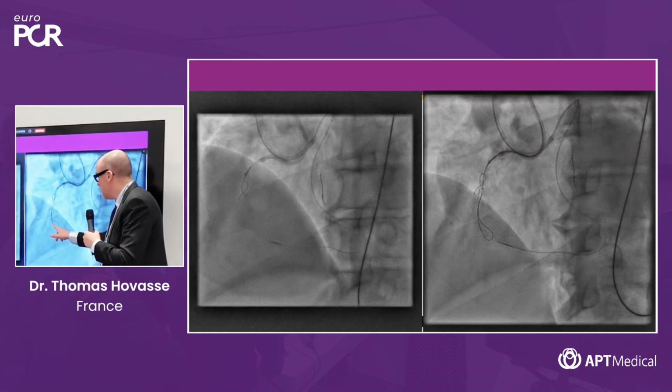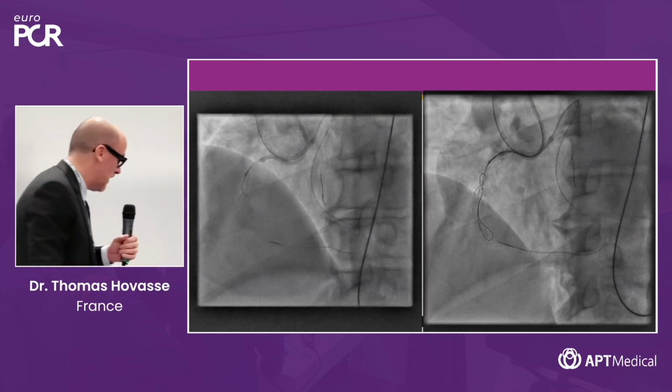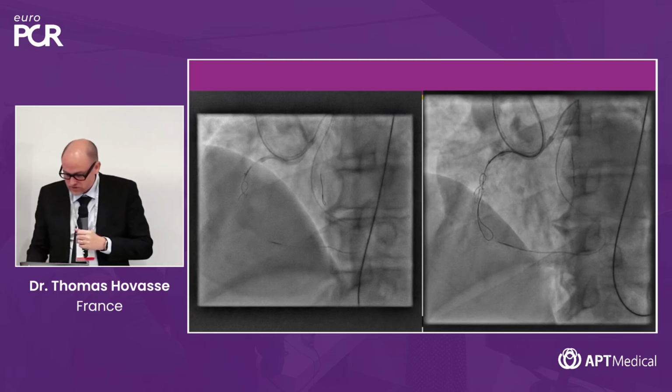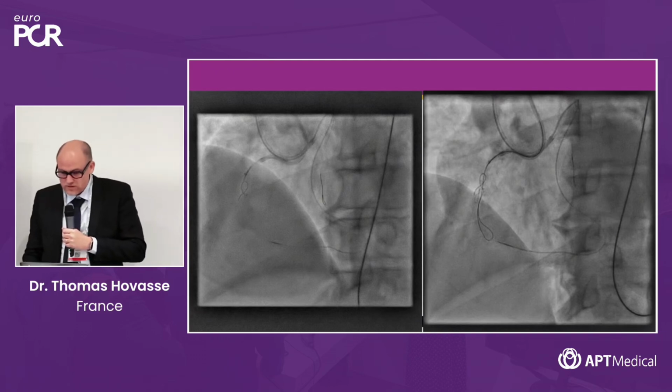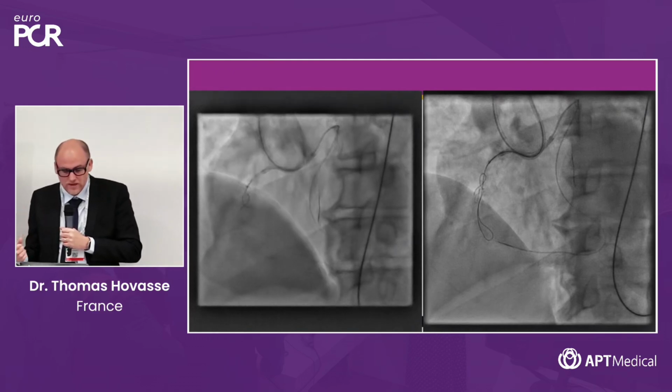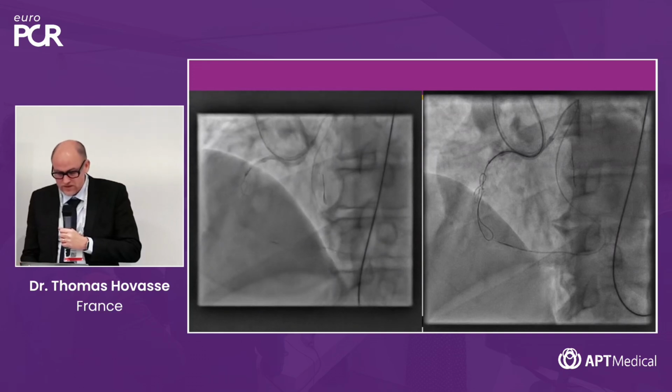So the loop here is a little bit big, so you don't want to advance too much with such a big loop. But you now have the two wires, antegrade and retrograde, in good position here to perform the reverse cart. And you solve the ambiguity of tortuosity. You are for sure in subintimal space in both antegrade and retrograde, but it's not the worst part, the more difficult way to do the reverse cart.